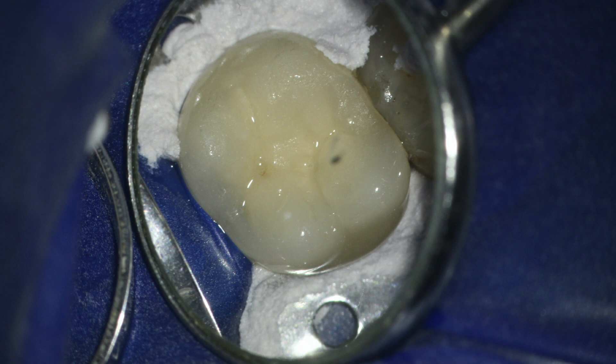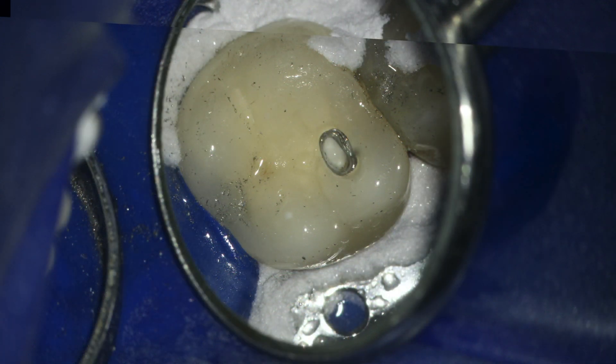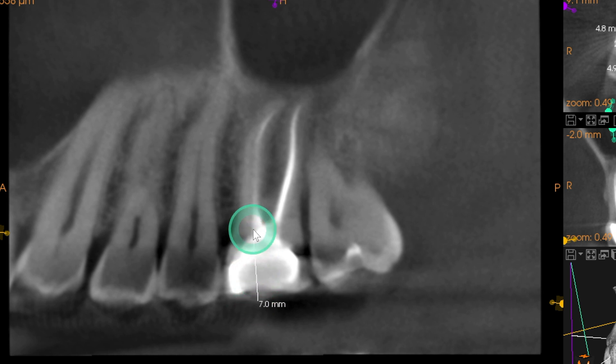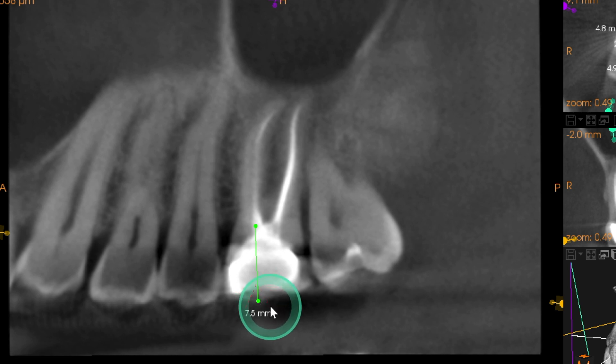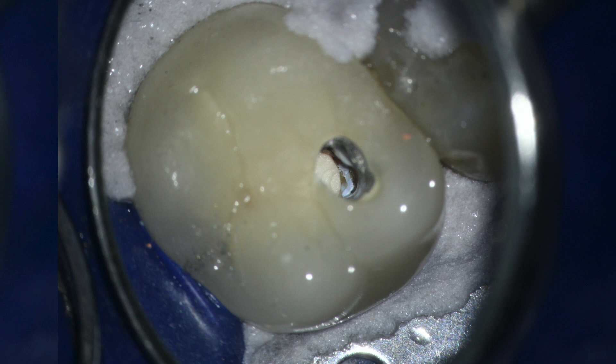For this particular situation, I chose a single tooth isolation technique using rubber dam block-out material to create a nice aseptic field. I started my access through the restoration using the markers developed from the cone beam scan. It's up to me now to maintain the vertical orientation in order to find these canal systems. I always encourage establishing a target vertical depth point — going back to the cone beam scan to understand the level from the occlusal surface to where that root canal system should be. As I advance deeper inside this tooth, we begin to see some evidence of where that previous root canal treatment was done.